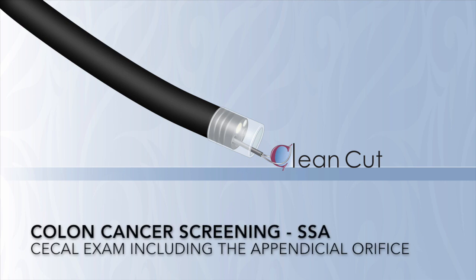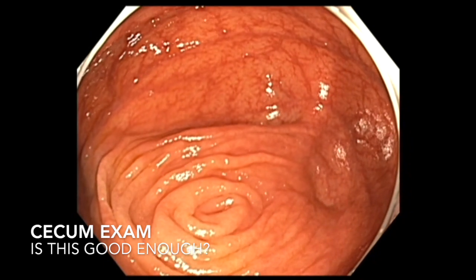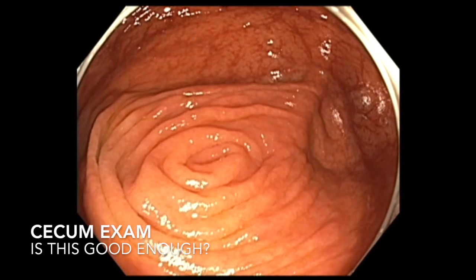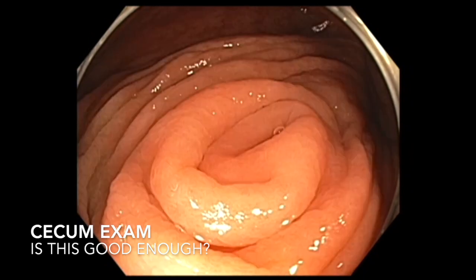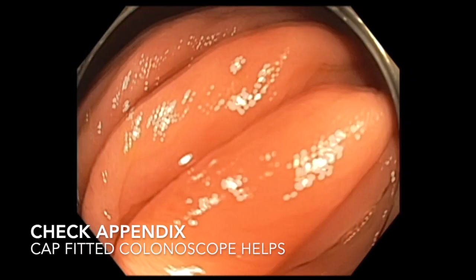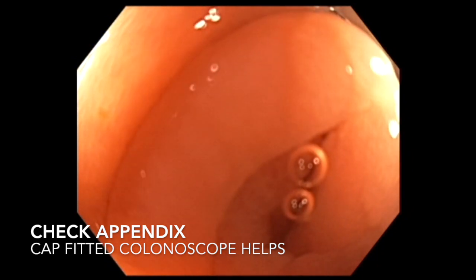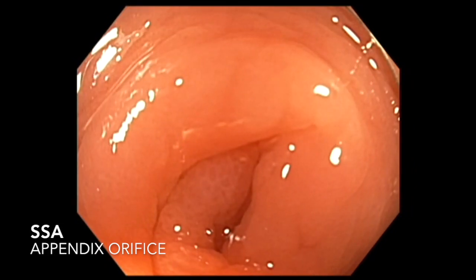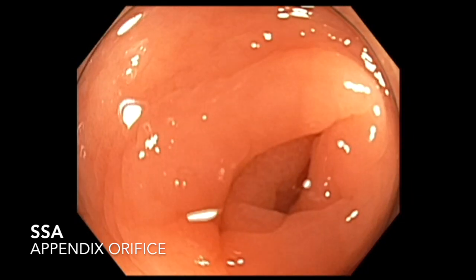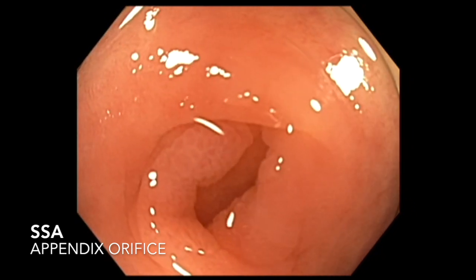Let me share with you how to examine the cecum. The cecum looks good, the appendiceal orifice looks good, and everything looks good — but if you use a cap and try to look into the opening of the appendix, you will find lesions that could be easily missed. Here is a subtle flat sessile serrated adenoma.